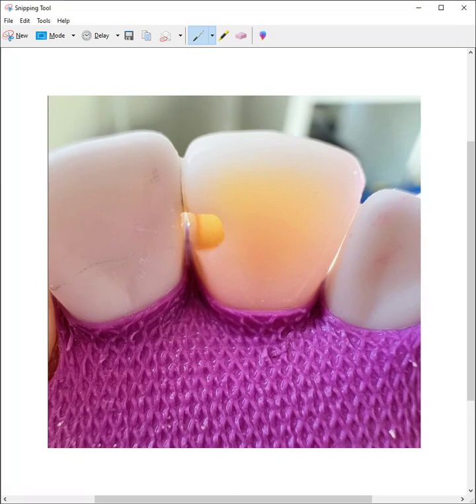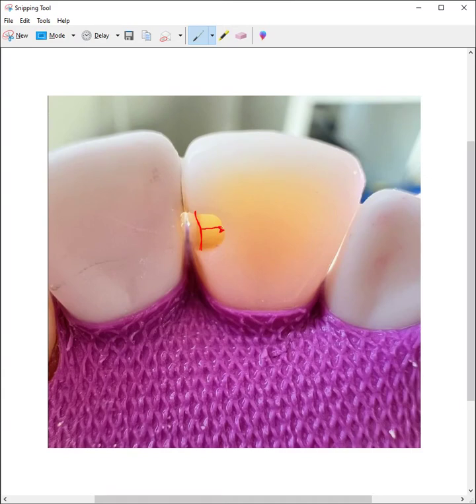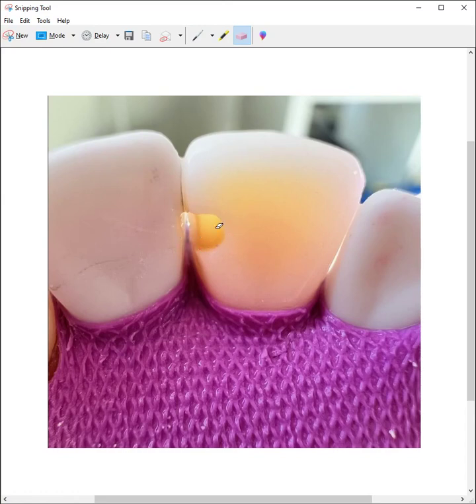So this is your DEJ right here. And you can be 1.5 millimeters going this way. I think you're just there. You may be a little bit overextended, but just be careful that you don't go past that. Just get it to that 1.5.